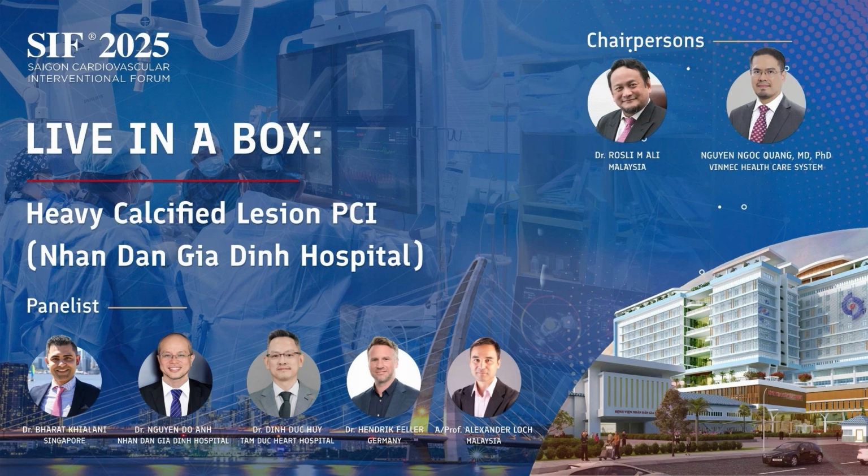Then for this region, for me, rotor first. It depends on the guide wire bias, but I just do rotor first, then check the IVUS again, and then try to do the next step. Actually, in Japan, we have two devices, like rotor IVL or rotor OCT, or two rotor. So we just do rotor first, then check IVUS again. That's our strategy. Yeah, so you see the home people here maybe prefer IVUS because you can see the whole thing from LAD to the ostium.